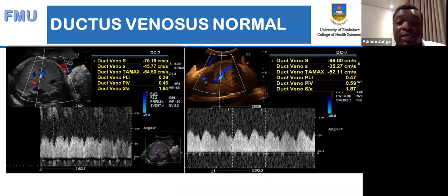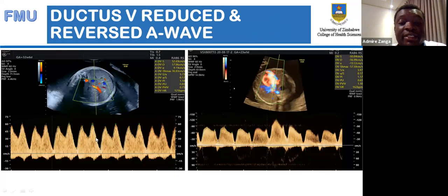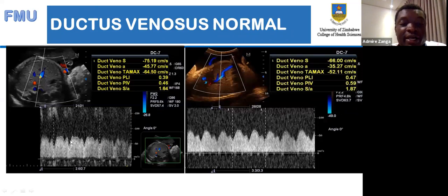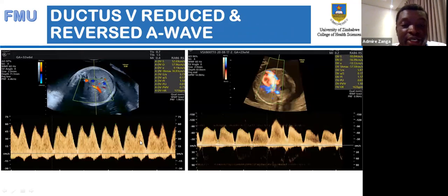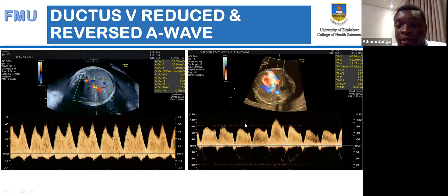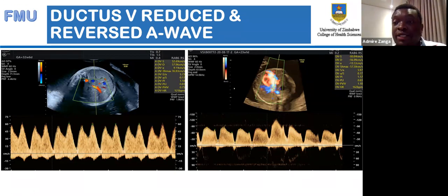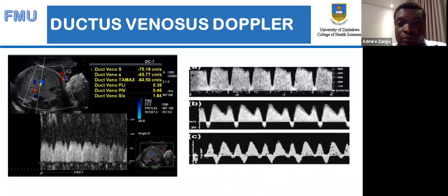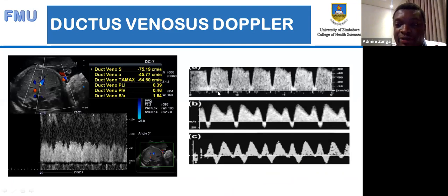The ductus venosus — normal waveforms show a positive A-wave. In deteriorating cases, the A-wave becomes reduced, meaning there is now resistance at the level of the heart, and it may show signs of reversal pointing towards cardiac failure. The ductus venosus deteriorates starting with a high PI and reduced A-wave, then reversal. This progression is visible through the waveform graphics.